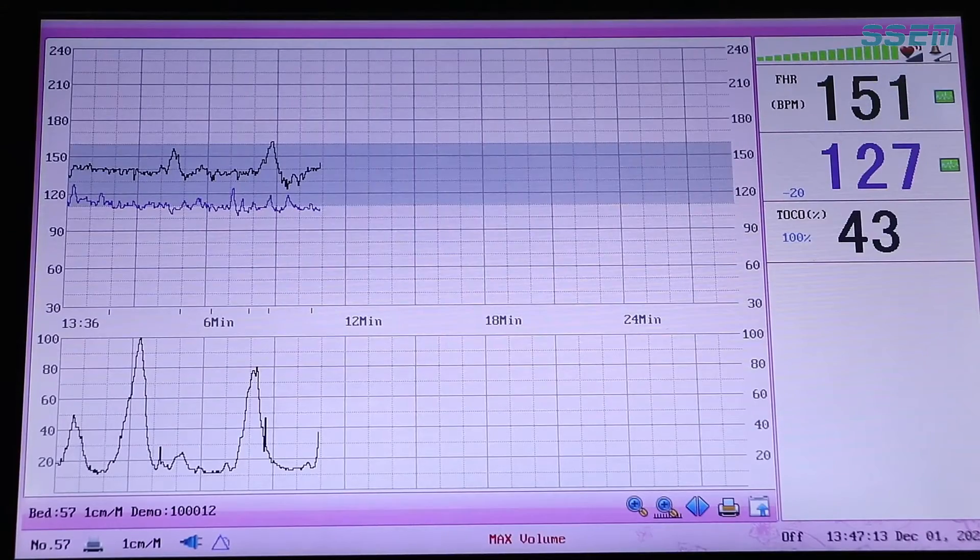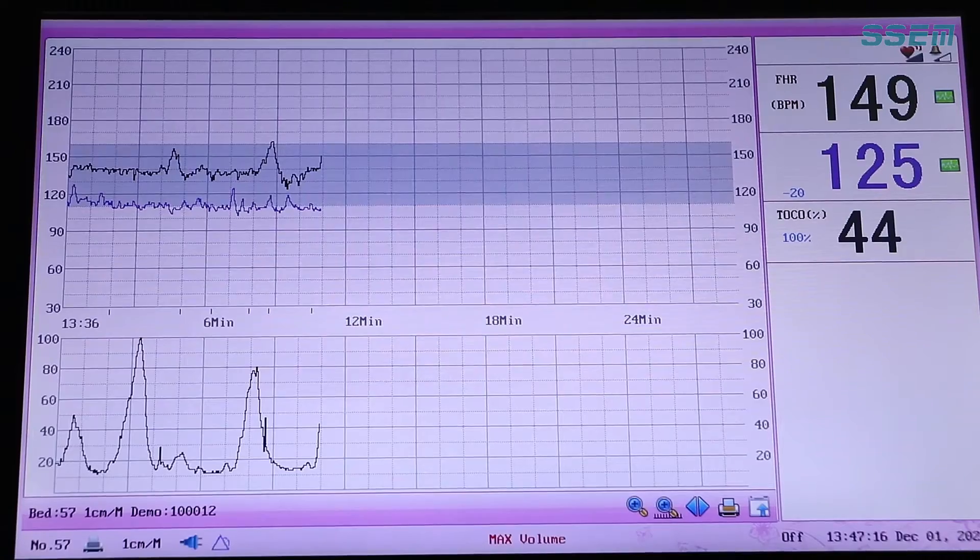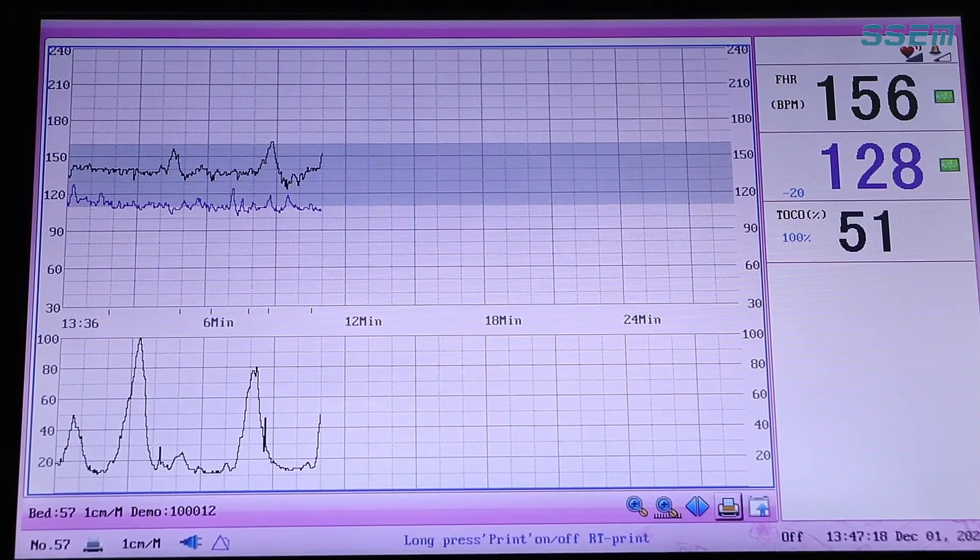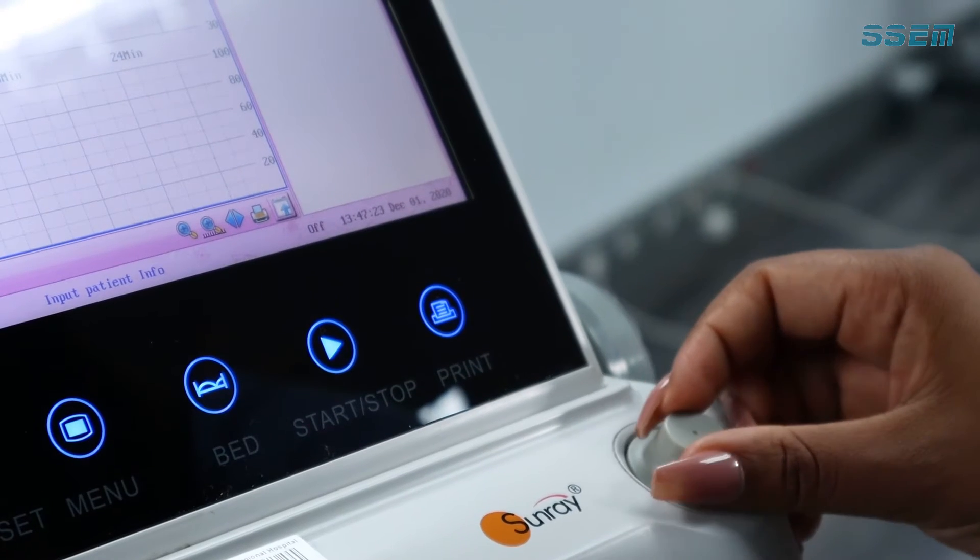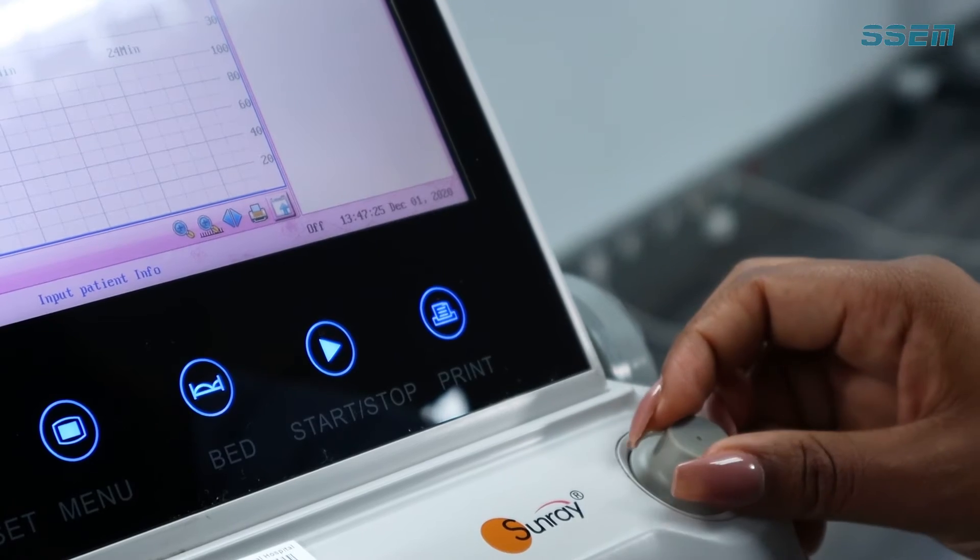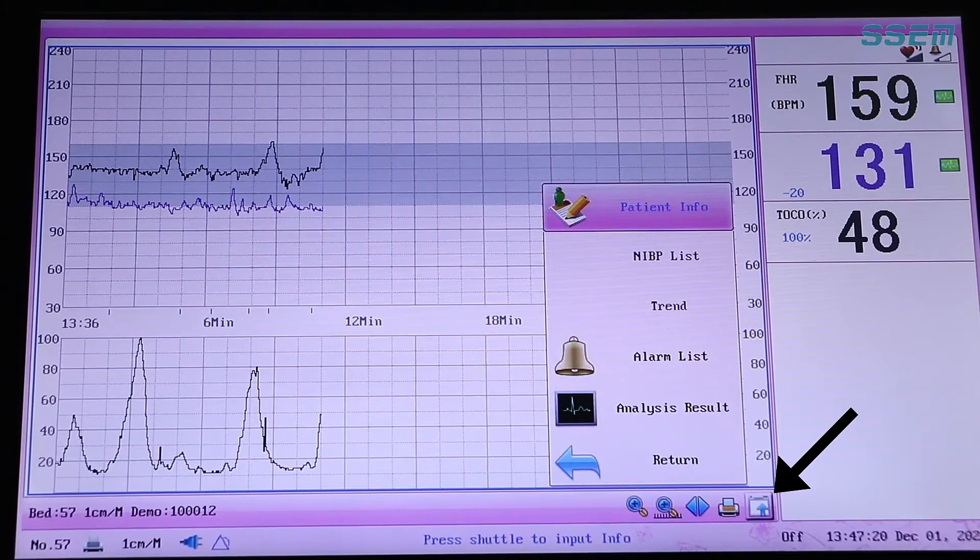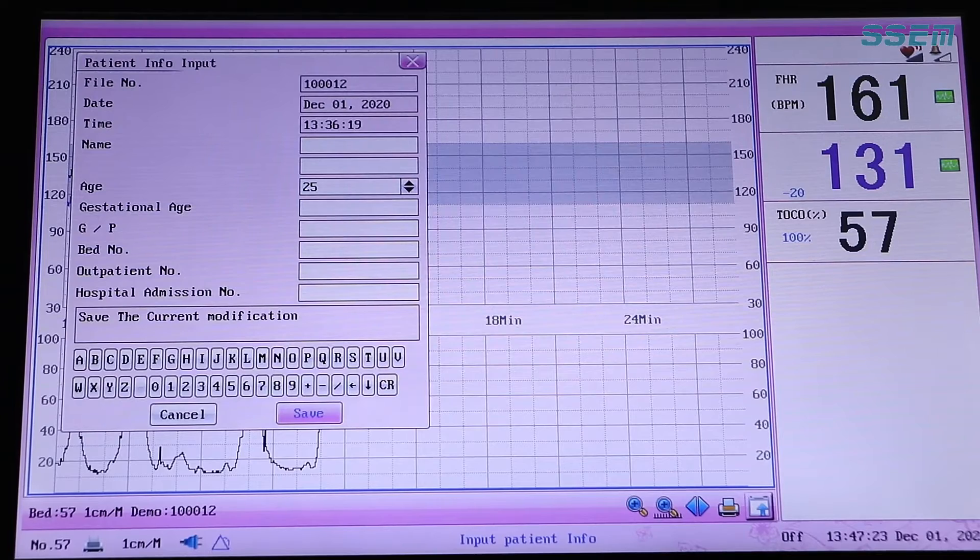Inserting the patient's demographics. Press bed. Pressing bed puts a blue border around your monitor tracing giving you access to the inner menu. Using your control knob rotate to the file. Push it once to select the file. Select patient info.